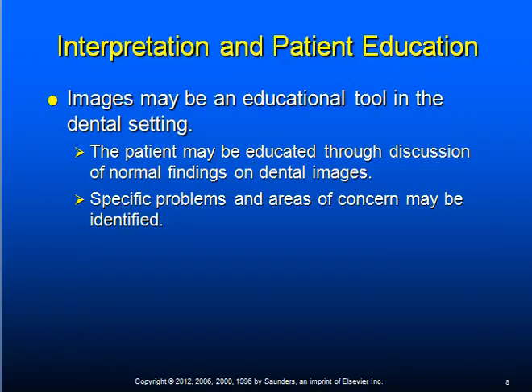Images may also be used as an educational tool in the dental setting. The patient may be educated through discussion of normal findings on dental images, and specific problems and areas of concern may be identified. Educating patients using dental images can help everyone work together as a team for the benefit of the patient's health.